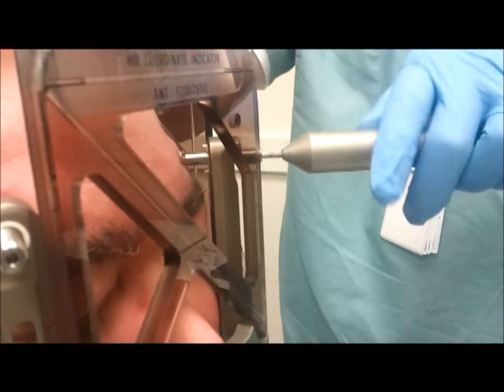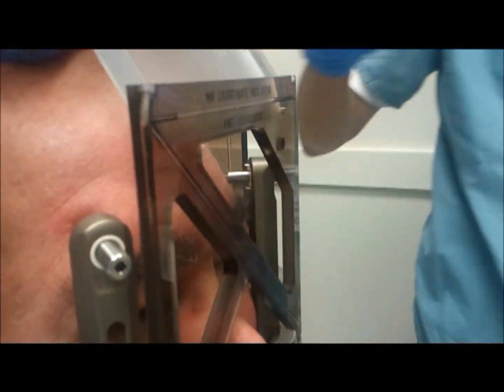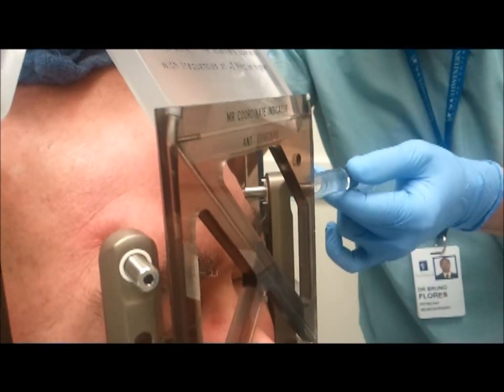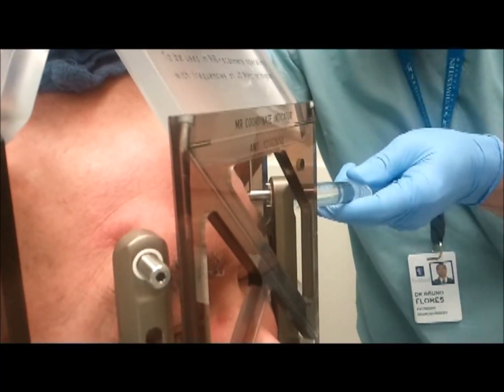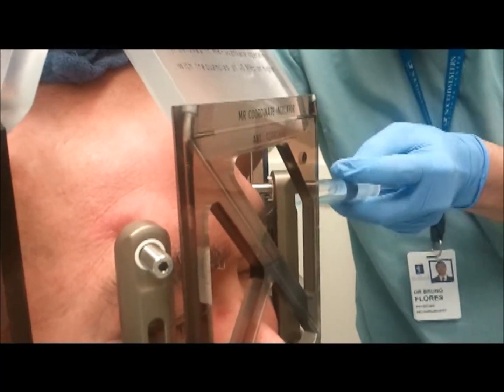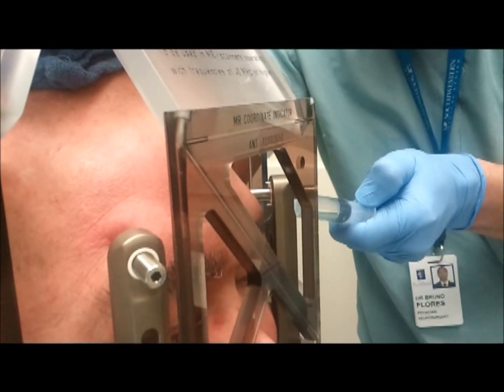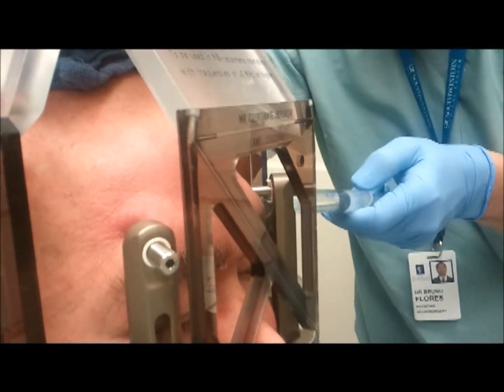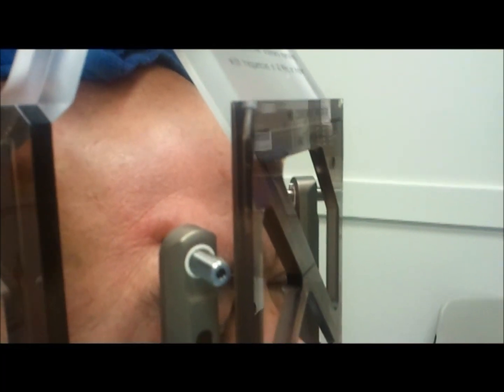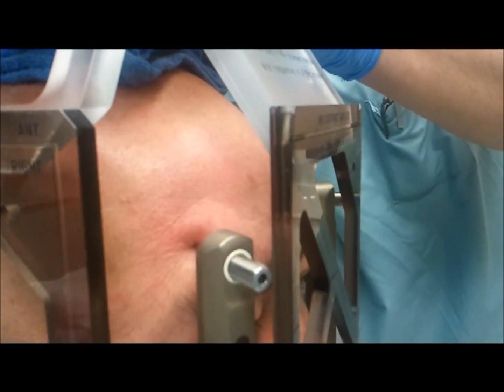Oh, that poked. Which one? That one hurt — the left. It's getting a little bit more medicine. One small poke here. While we wait a little bit, I'll work on the ones in the back.